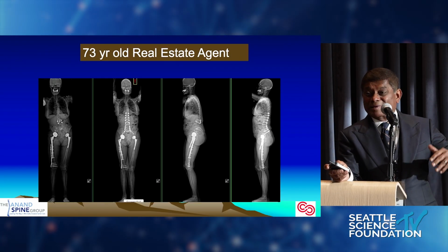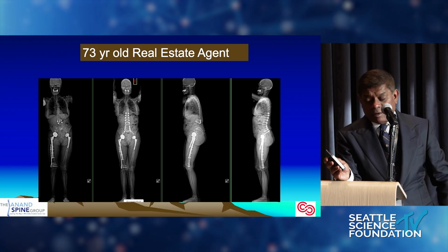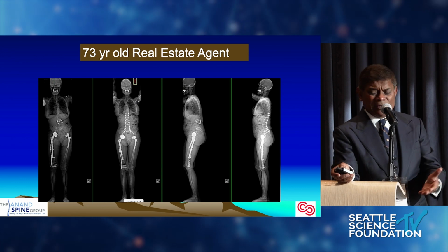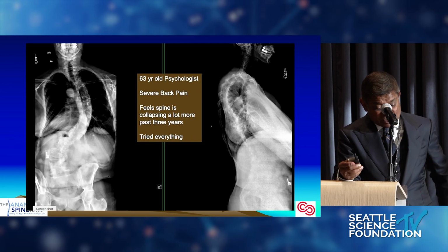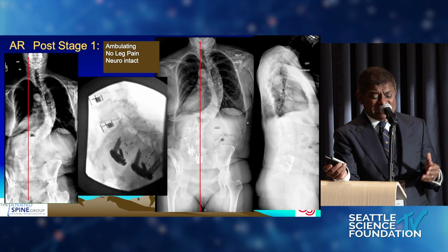Basically, L3 to S1 was fused, but luckily, thank God, L3-4 was not united. Went in, took the screw out and the cage out. Did an ACR, lined it up, and completely corrected. Single osteotomy, nothing was taken out. And then similarly, severe pain goes away. There are severe cases today. I said, what works? Even though severe cases, is it possible or not?